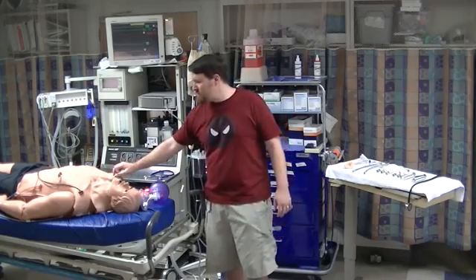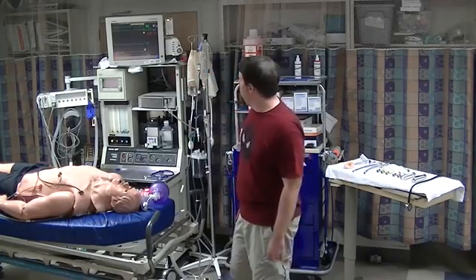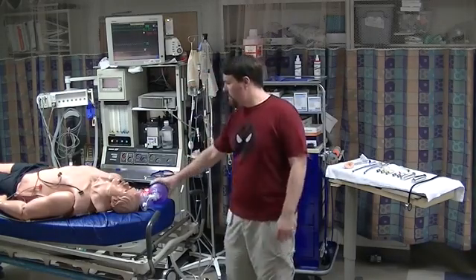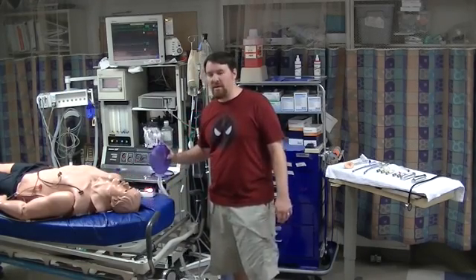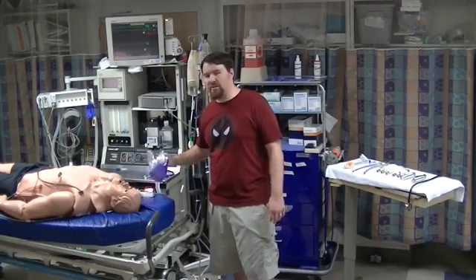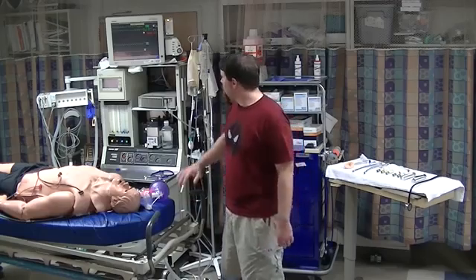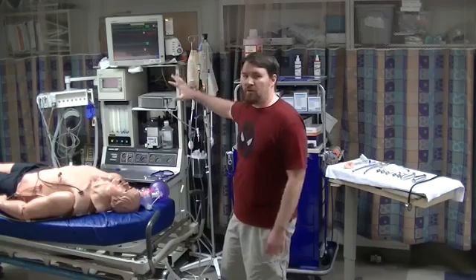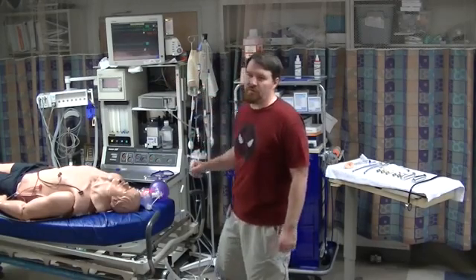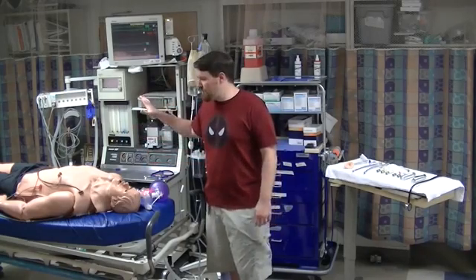He has lead placements for EKGs and is on his monitor. He has oxygen running, either through a nasal cannula, a non-rebreather mask, or being ventilated through a bag valve mask. He has saline in his IV. You need to know all of this long before you ever start to perform any sort of exam or skill on a patient.